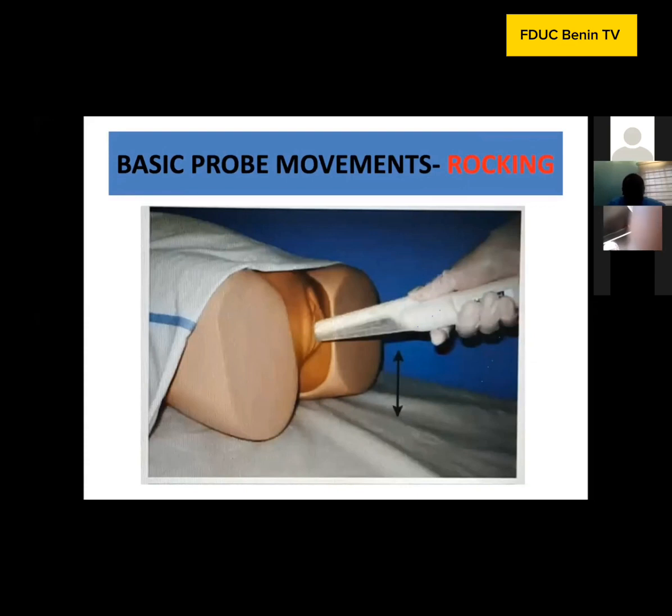Now, those other sliding movements, those are for abdominal, right? No. That's about the orientation of the image, but let me just finish the slide and then I can stop there. Okay, all right, move on. So I'll stop just 2 minutes before this point. Okay, good. This was to just talk about the orientation and for them to understand how we orientate ourselves when we scan.